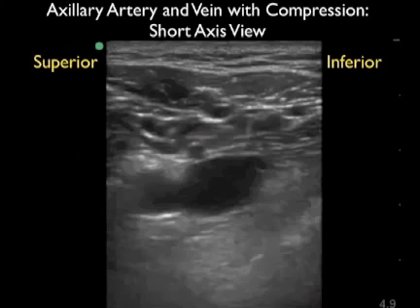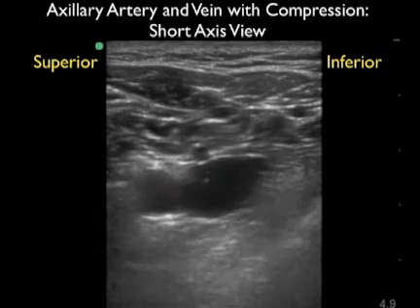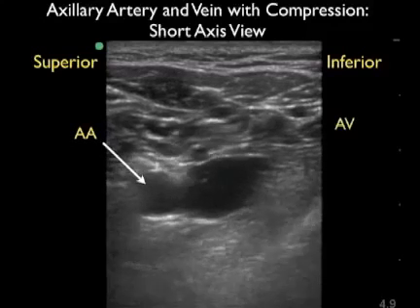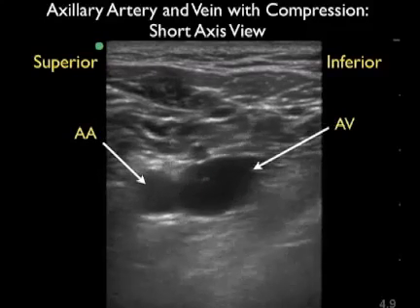Here's another image of the axillary artery and vein taken from a short axis configuration. Again we have the probe marker, indicator towards the patient's head, superior to the left, inferior to the right. Thus we see the smaller axillary artery to the left or superior and the larger axillary vein inferior toward the right of the image.